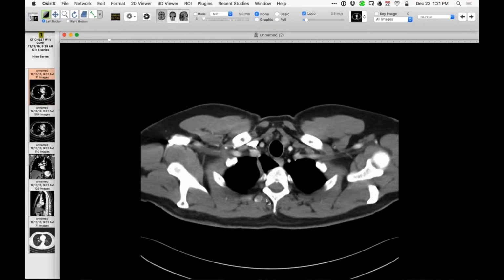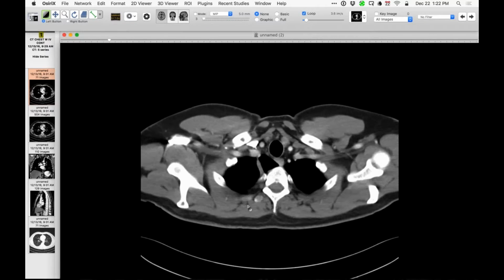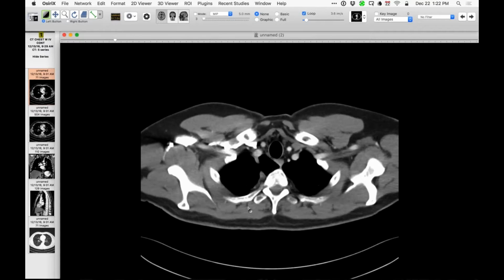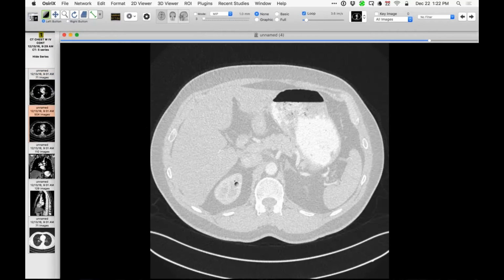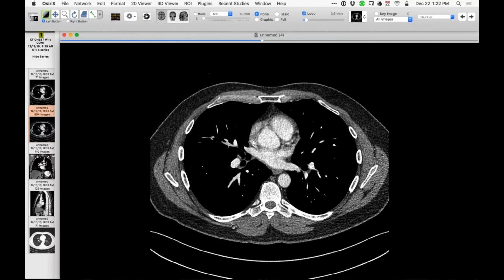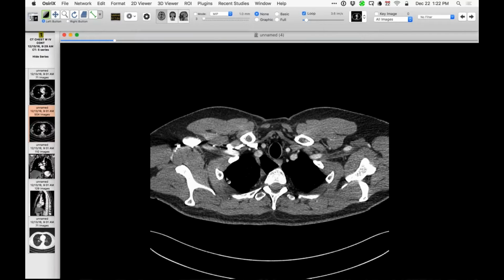So it's going across there, and it's going to drain into, as best I can tell, the right brachiocephalic vein up there. And what's interesting now is, let me just bring up the thins to show the same thing a little bit better. So let's first just scroll up there, go all the way up where it crosses over, as you can see there.